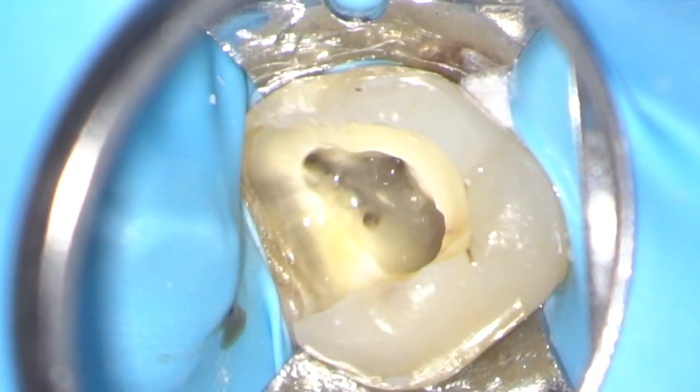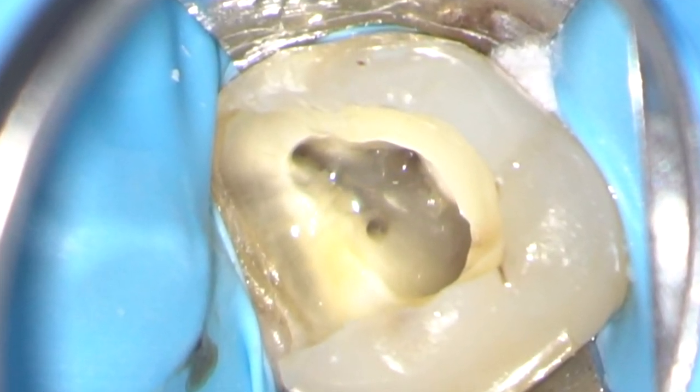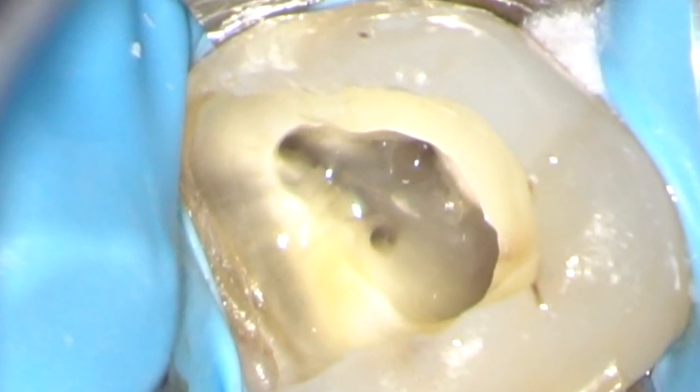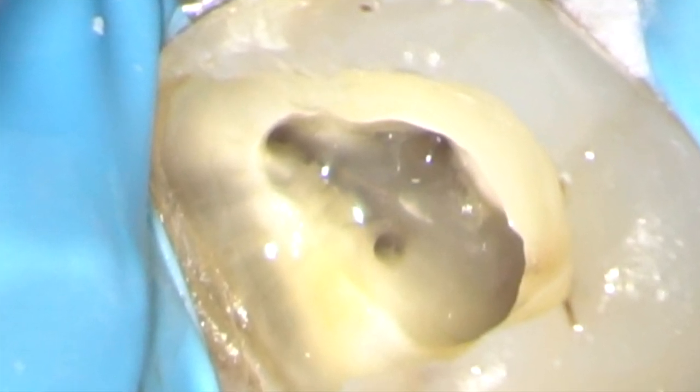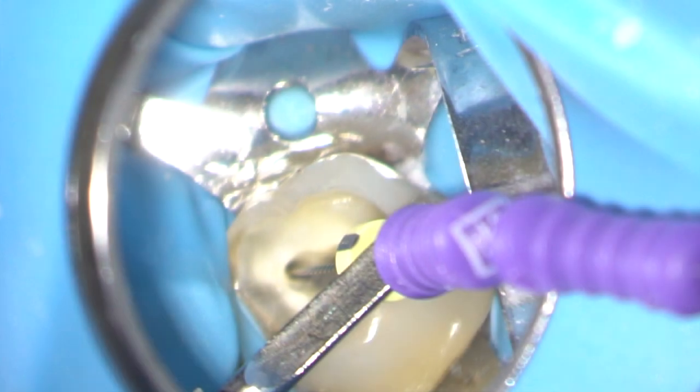Conservative coronal flaring has been carried out on the four main root canals. It's now time to estimate the working length of the root canals using an electronic apex locator. A file - in this case a size 10 flexor file - is introduced into the root canal and then gently wound down to the zero reading. In this case it's going slightly beyond, so I'm backing up until I get the reading correctly at zero.